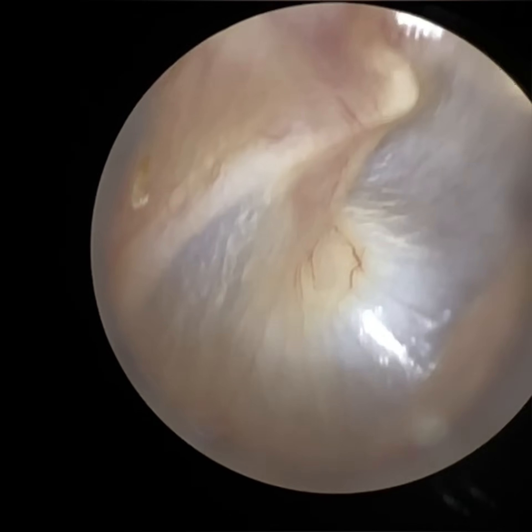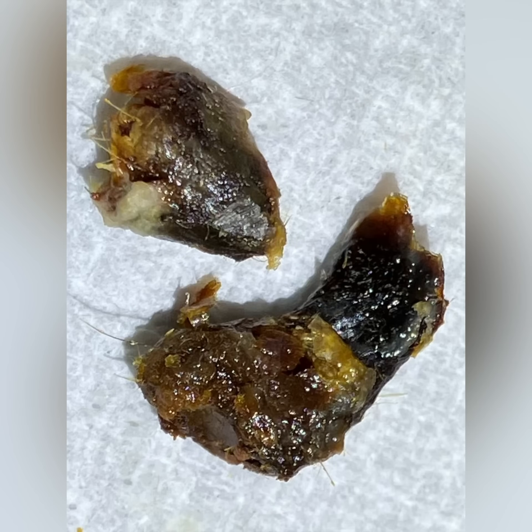So just re-entering the ear, having a good look around. And there are the wax plugs that I extracted from both ears. The larger one at the top is from the left side. You can see some parts are really dark — it's oxidised, it's been there for a while.